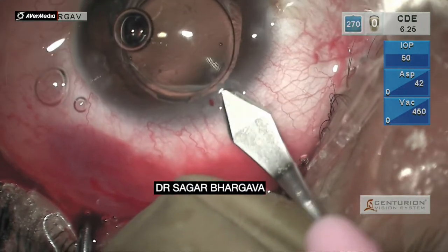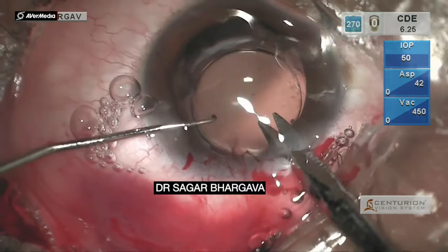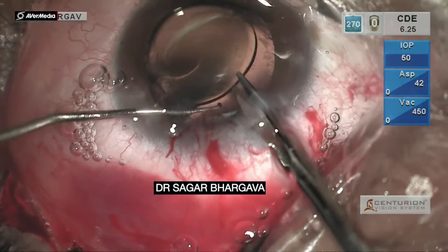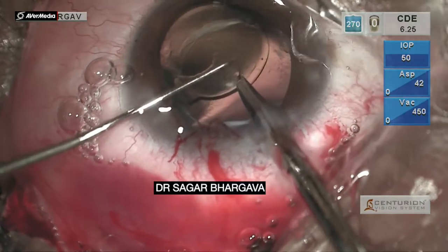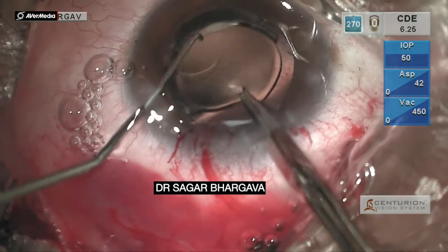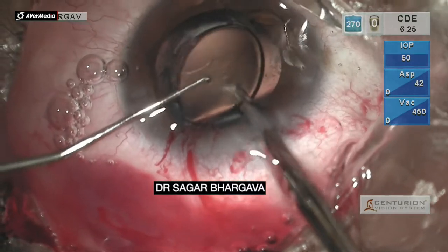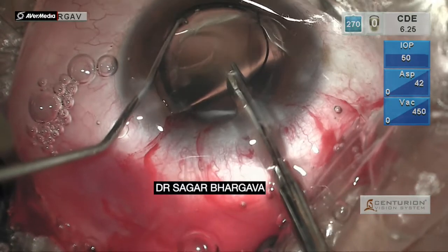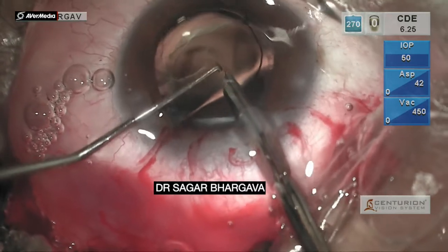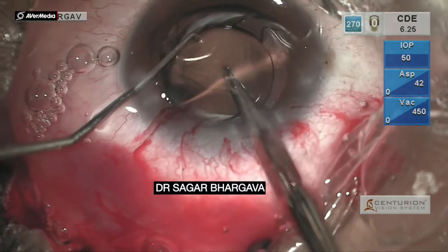A superior 2.8mm incision is made. A Vannas scissor is used to initiate a cut in the optic of the lens. The optic of the IOL is stabilized with the dialer, and with the left hand steady, the right hand is used to cut the optic of the IOL in one go. You get two pieces of the lens.